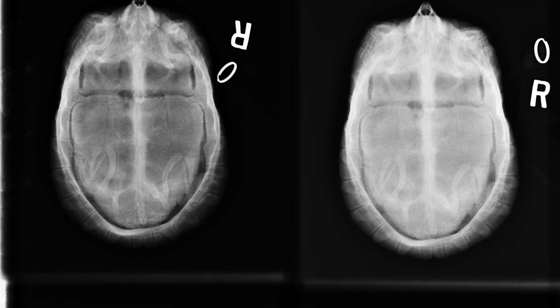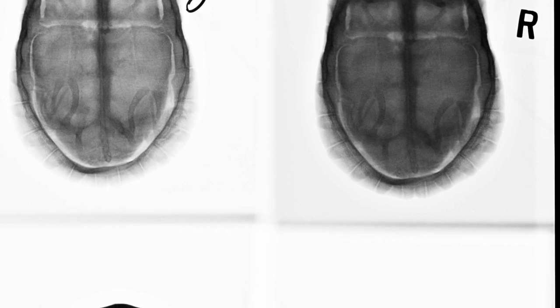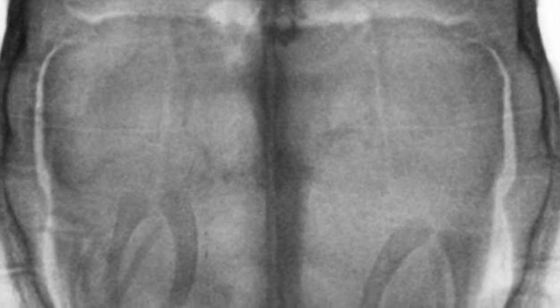If you're a radiologist or a vet student in training, this is kind of cool. Notice right there at the center, right at the hinge — I'm pointing at it but you can't see it. Notice the difference between these x-rays and the ones coming up. These are without contrast. We actually used barium and injected it directly into the lesion itself.